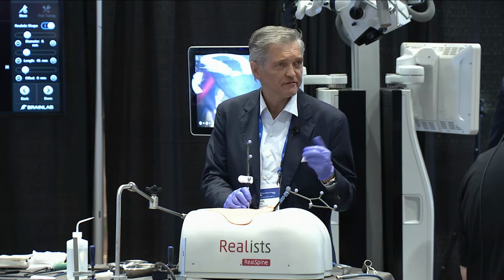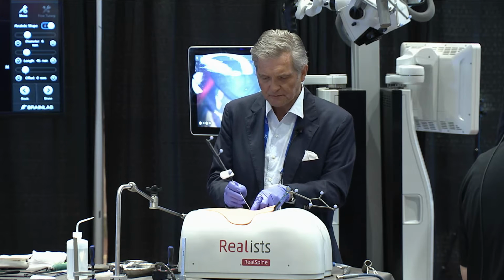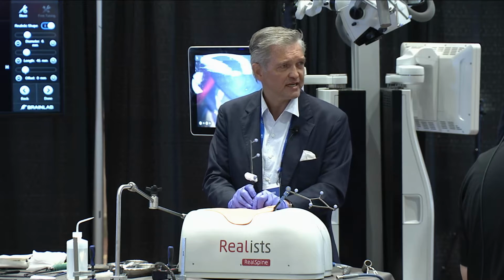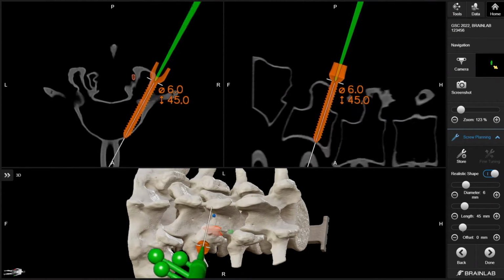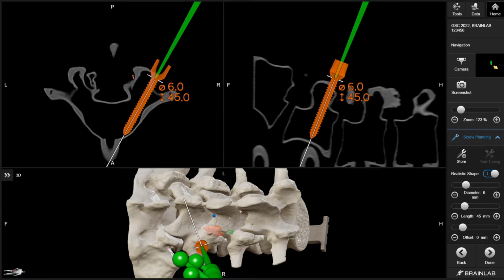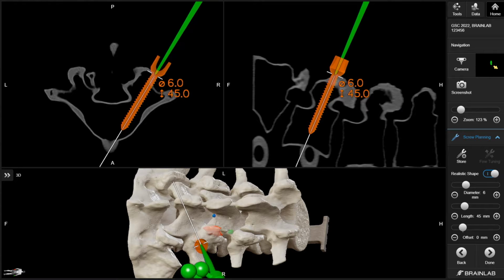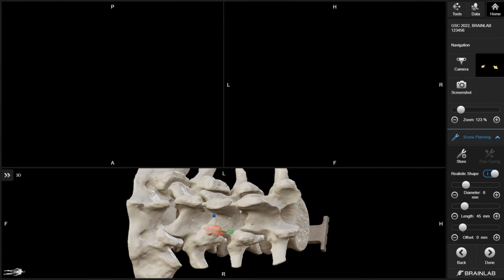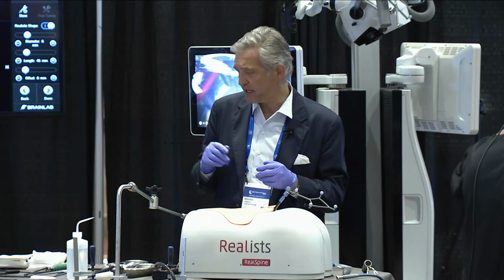So 6045 is going to be the size of the pedicle screw at L4. And then I go through the fascia again here, a little bit lower. I'll pick the L5 pedicle screw here, and that would be a nice trajectory and size for the L5 pedicle screw. So the same thing, 6045. So now we know the size and the length of the pedicle screw.